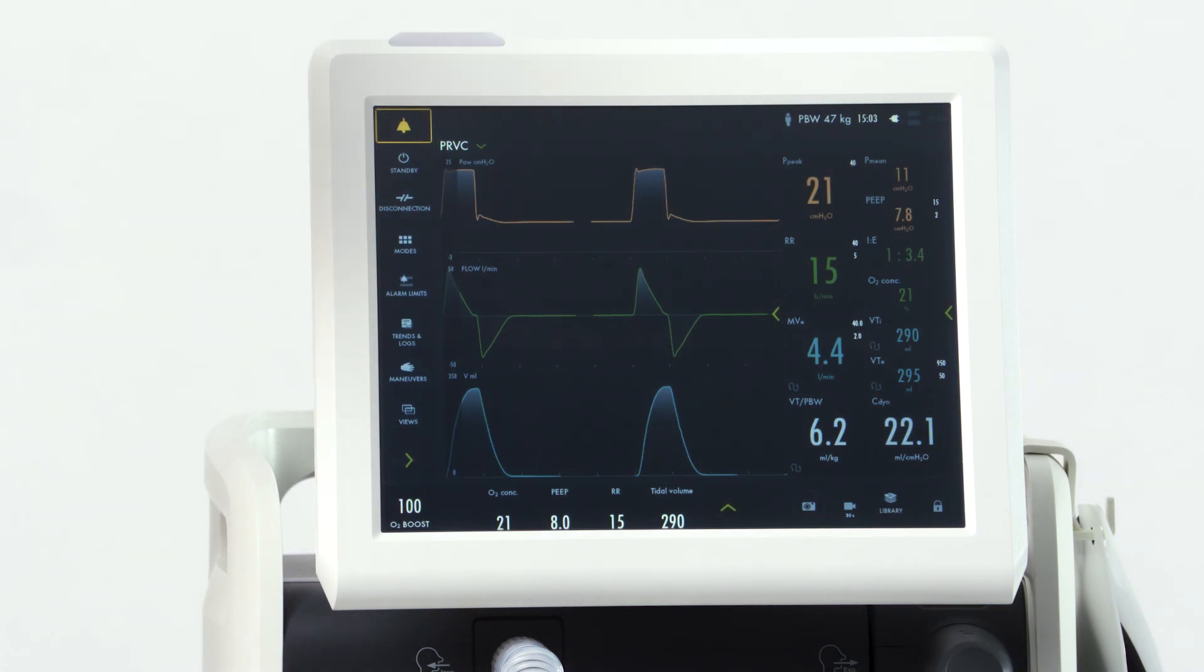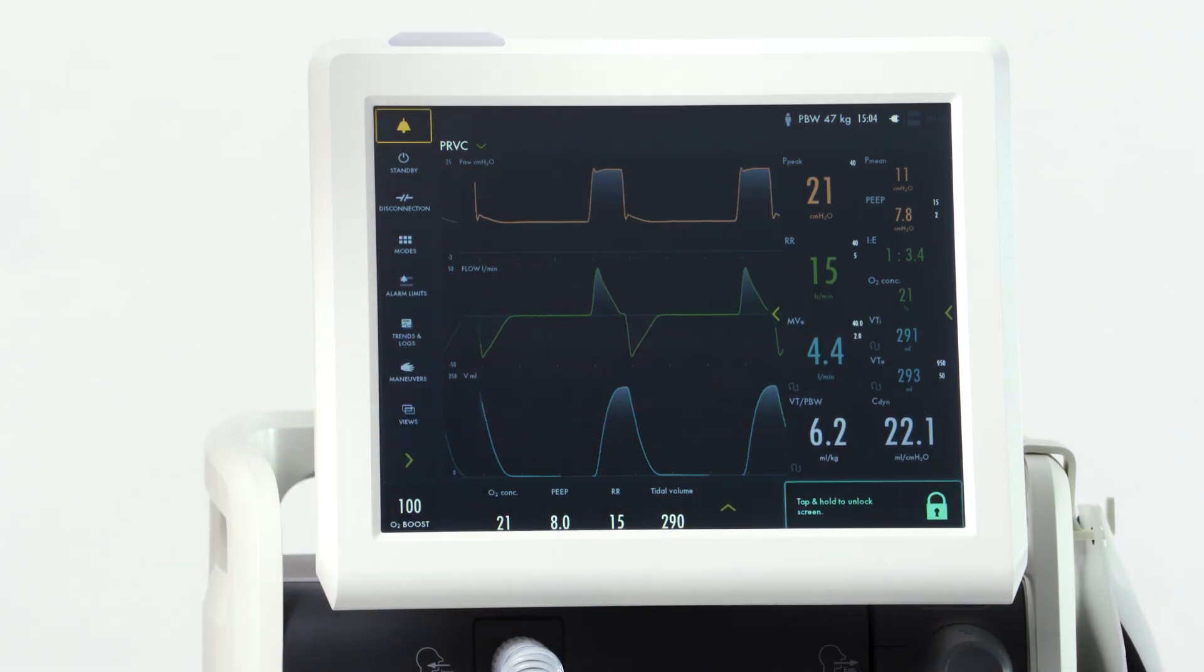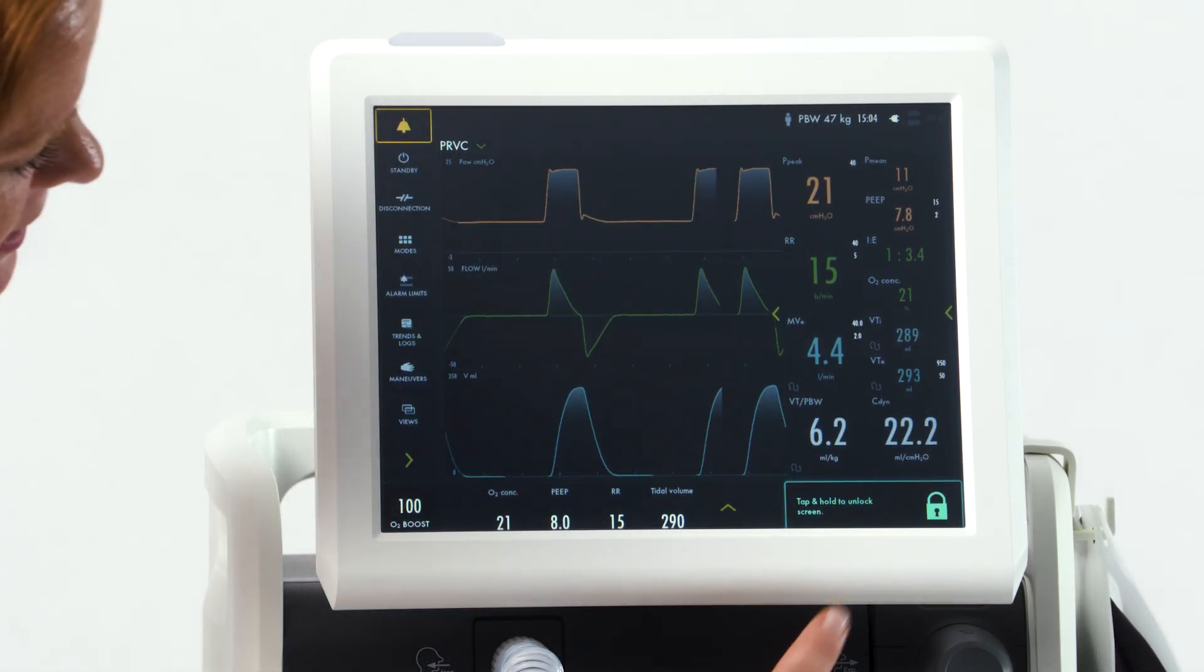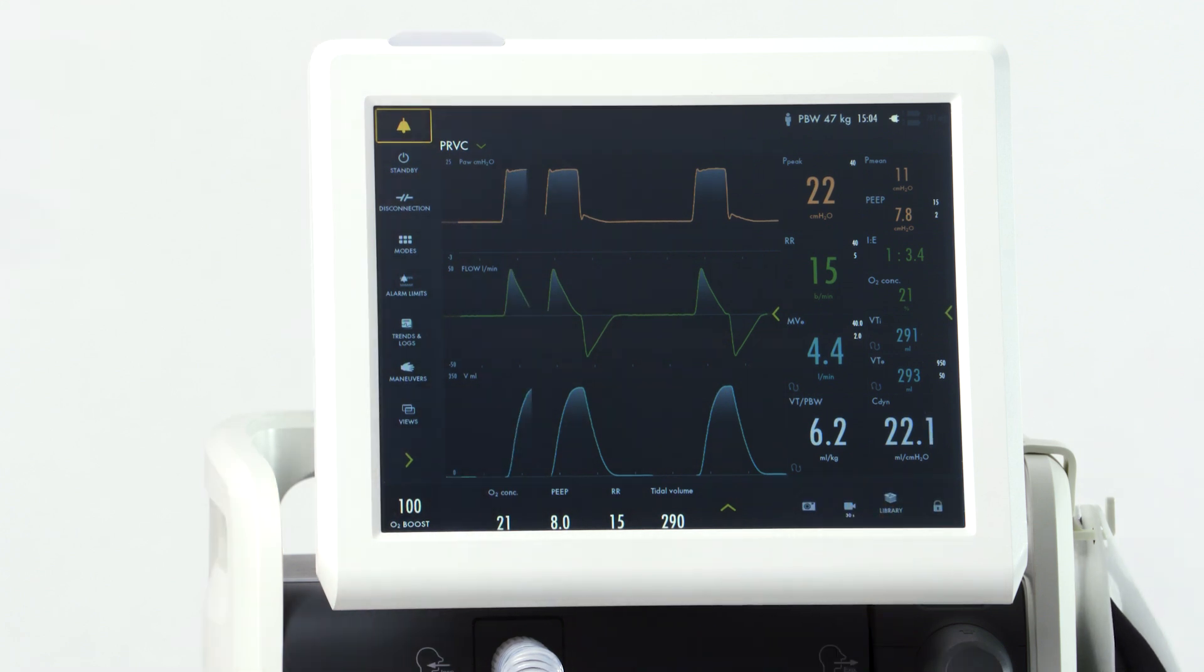To lock the screen, simply press the lock and hit lock screen. This will allow you to clean and use for transport without making changes. To unlock, simply press and hold until the blue bar goes across.